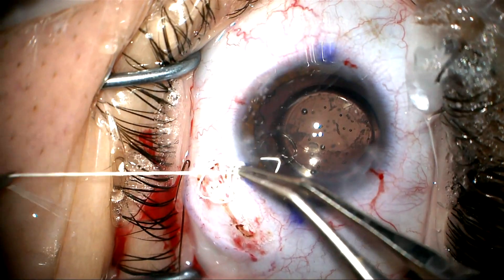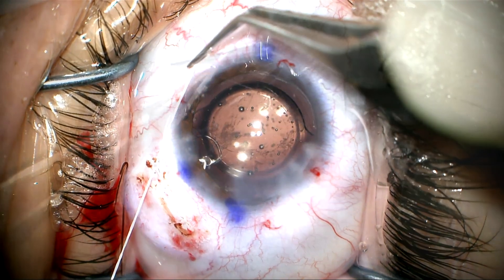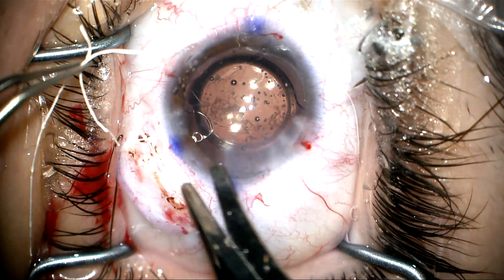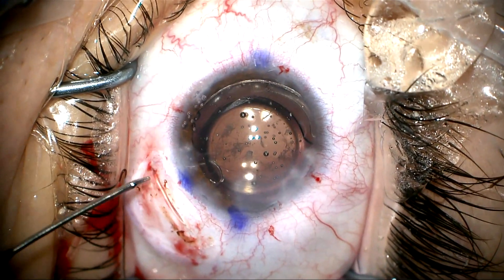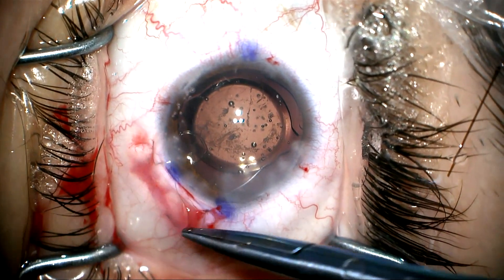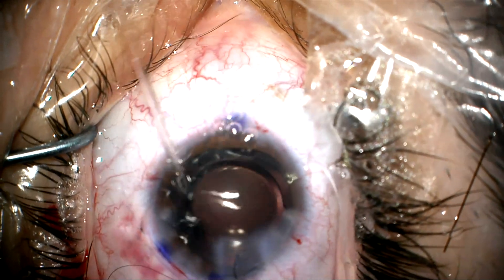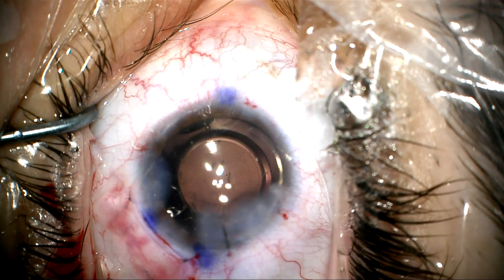Now that the lens is in place, we're going to go ahead and adjust the tension on the Gore-Tex suture, and once we've done that we're going to lock it. We don't want to make this too tight — just tighten enough to balance the zonules on the other side and stabilize and center the lens-bag complex. We'll cut this, rotate the knot into the eye so it's not going to be exposed, and pull on the capsule tension segment so the suture will be under the surface of the sclera. We close the conjunctiva and remove the viscoelastic from the anterior chamber with the irrigation-aspiration handpiece. You can see that this is very stable — the lens is very well centered and on the correct axis. We give a little nudge to make sure it's stable, and the case is completed.